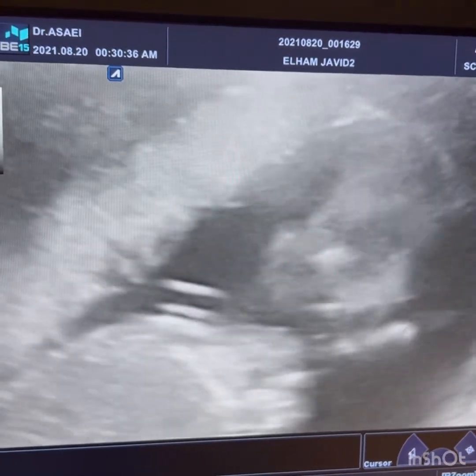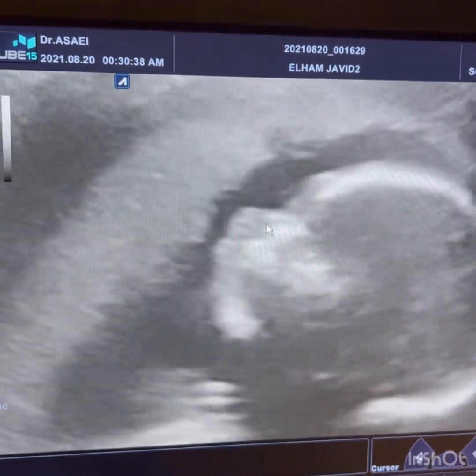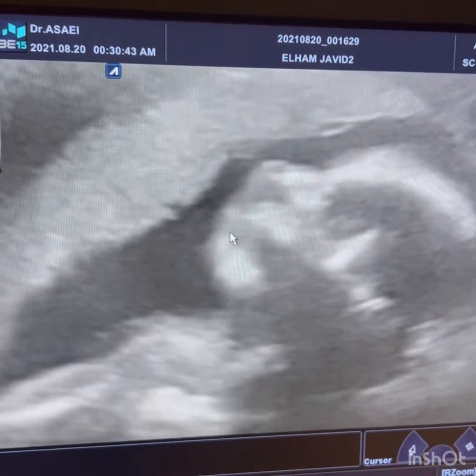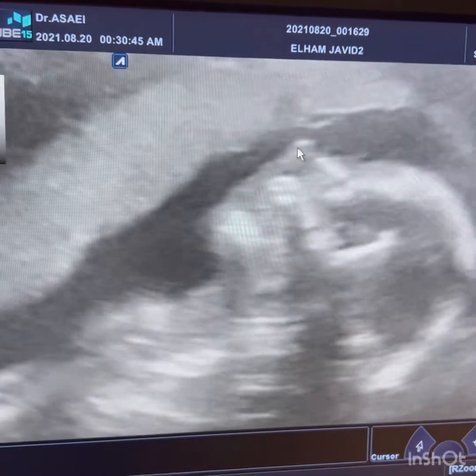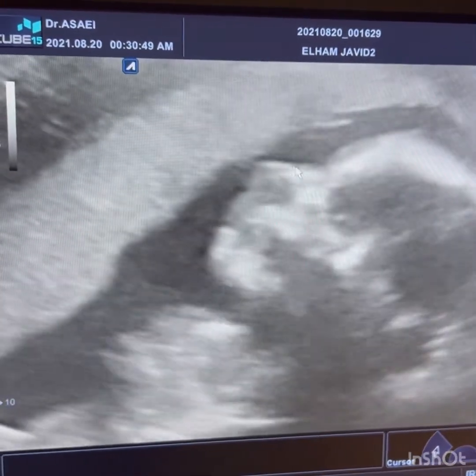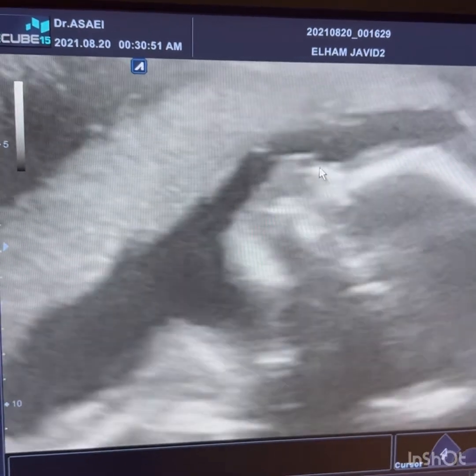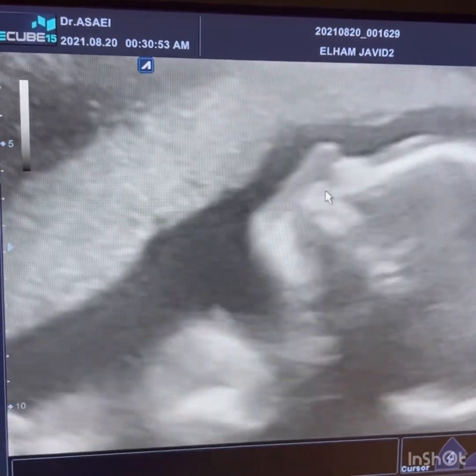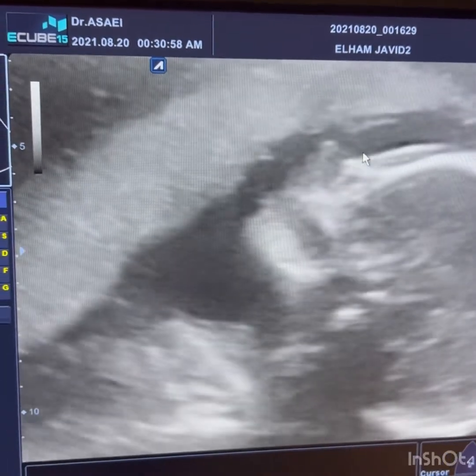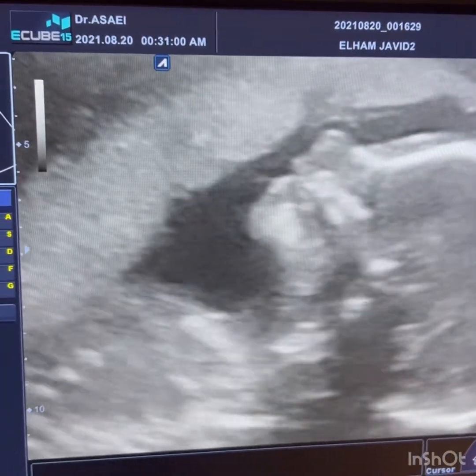fetus. There are many charts to estimate fetal nasal bone in different gestational ages. But in my experience, in anomaly scan of 18 and 19 weeks of gestational age, it would be 4 to 6 millimeter. Here we can again review the nasal bone.